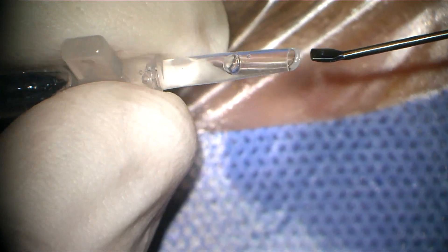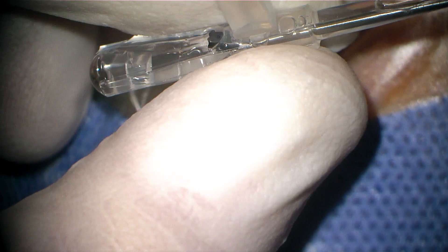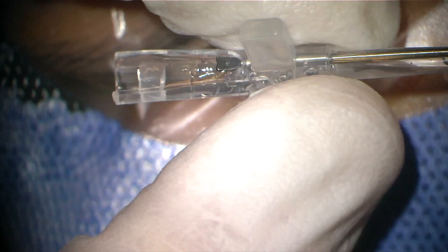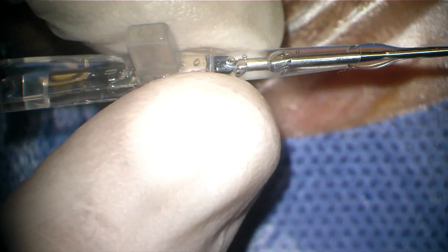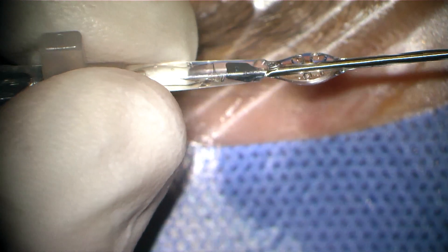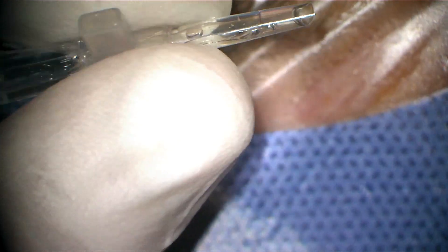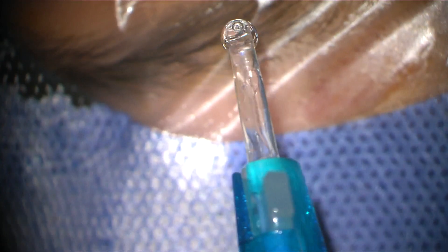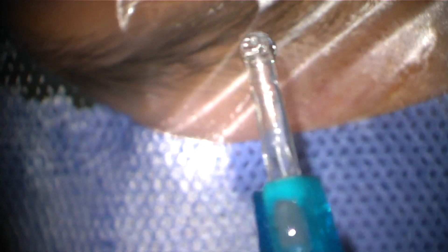Now we are going to grab the lens into the nozzle of the cartridge. Because the lens is extremely thin and fragile, we do not pull the lens; rather, we move the cartridge — the left hand moves outside the field while the right hand holds the lens in the middle. The lens is placed into the cartridge, which is then inserted into the dedicated injector system. The lens should be pushed with ease — no force is required. If force is needed, check that the lens is in the correct loading position.